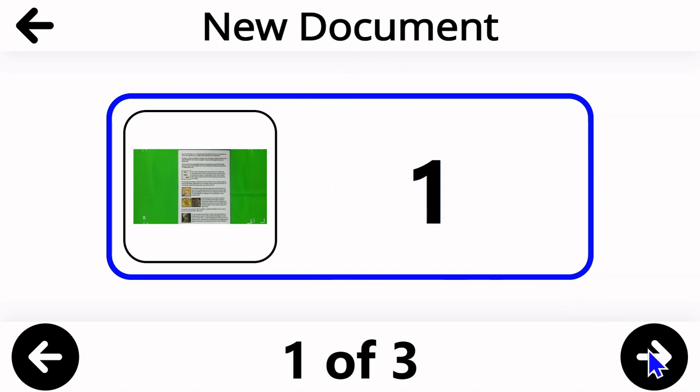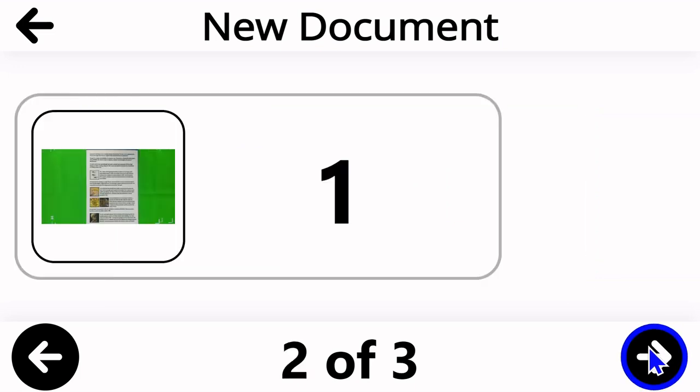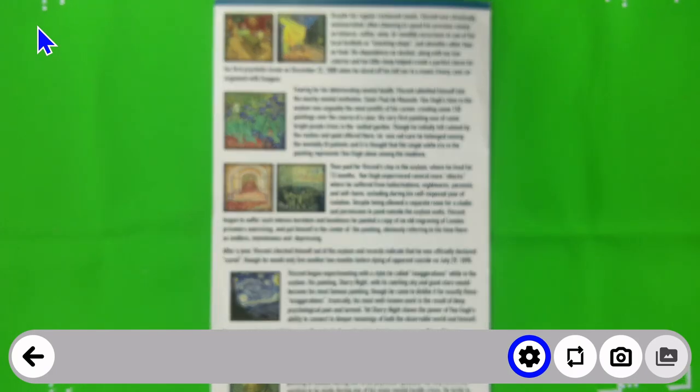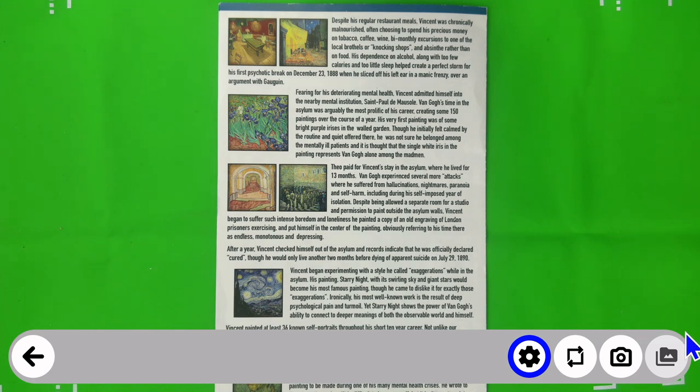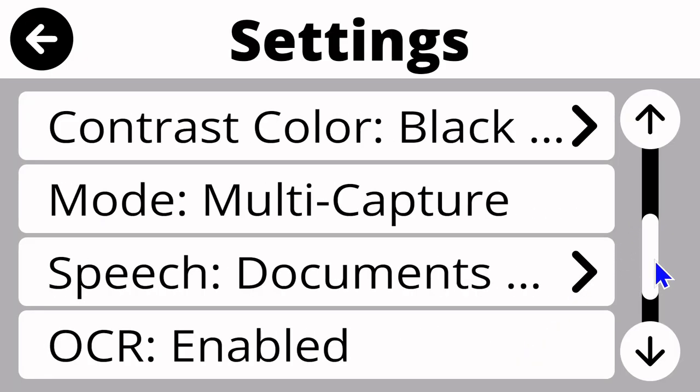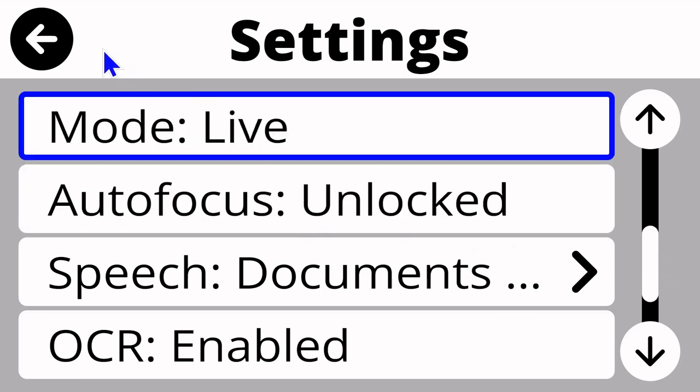It's just taking me there so that I can see it. I can read it. I can massage it a little bit if I want to, make sure that I have everything that I want captured. Now I can hit this arrow in the upper left corner here and it will navigate me back out to my live view. I am still in a multi-capture mode right now. So if I want to go back to standard live viewing mode, I need to click on my gear wheel, go into my settings, come back down and change my mode to live viewing mode, which is probably what you're going to use most of the time.